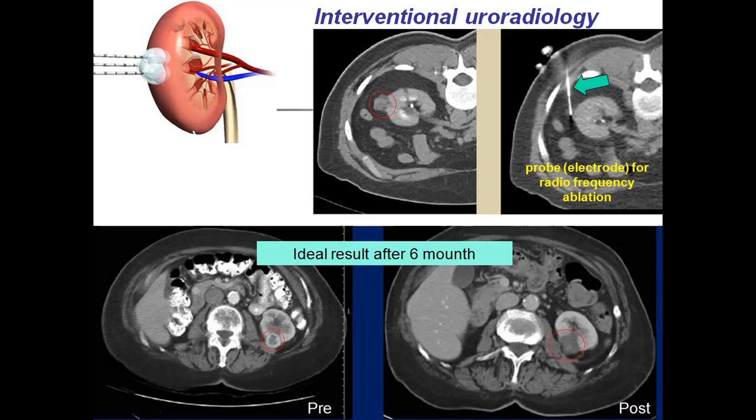When we ensure that the probe is inserted correctly, we heat it up to 100 degrees or even more, and destroy tumor cells in this way.